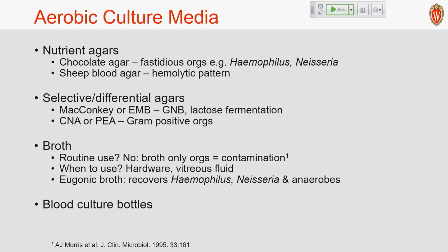What about broth? Well, when I started this, quite a few years ago now, every one of these samples would go into a broth. And it wasn't unusual to get something from the broth only. But as I've cited in this one paper from 1995, studies have shown that things that come out of the broth only are likely contaminants, and they don't contribute to the outcome of the patient. So we don't use it anymore routinely. But that said, there's a good reason to have it.